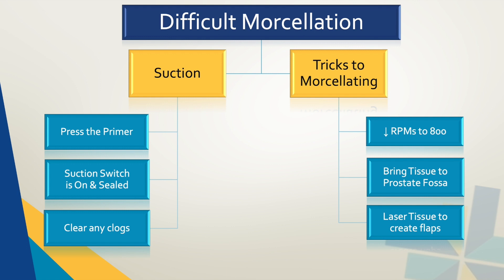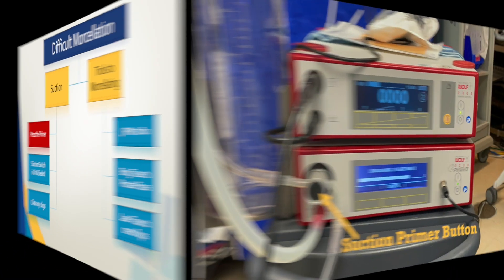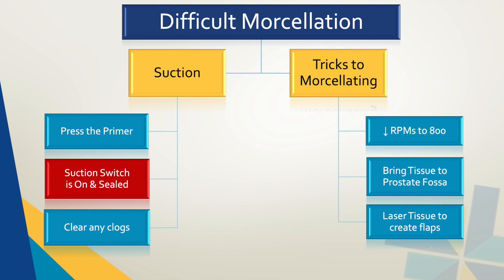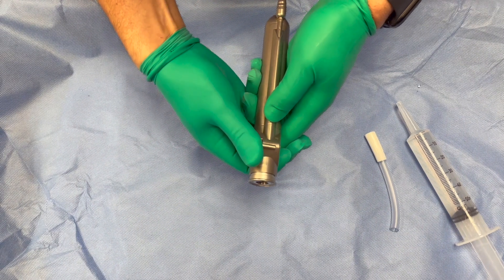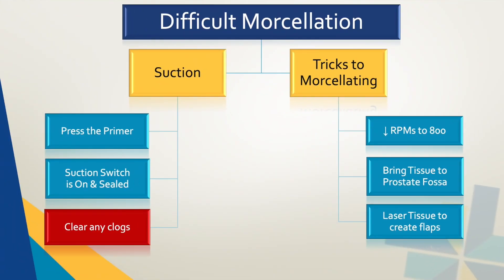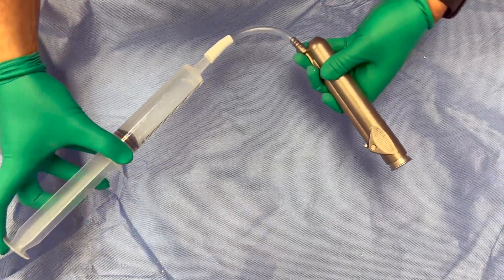Most morcellations are straightforward, but there are moments when it is difficult to engage the tissue and complete morcellation. Here we highlight a few tricks that can be helpful during those times. When having difficulty, first assess that your suction is working adequately. There is a primer button on the device box that will provide continuous high power suction — this can help clear the line. If this does not work, check that the on/off suction switch on the morcellator handle is in the on position and that it has an adequate seal. Finally, if none of that works, sometimes a larger fragment of prostate tissue can clog the morcellator and you need to clear that clog from either the handle or the blade.